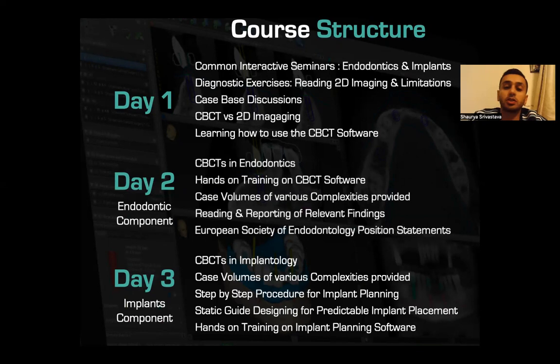You're going to be learning about CBCTs in implantology. You're going to be using the CBCT software for implant planning, that's the core diagnostics, and also learning how to make a static guide design. So it's a very new program. It's the first one in India that's going to be of this kind, and it's been adapted from a course at the British Dental Association too.